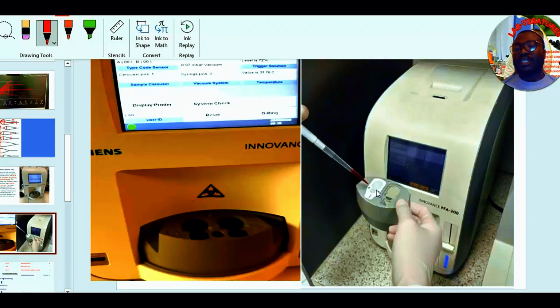So a small aperture will now represent where the tissue is injured, and your blood sample will be forced through it, and it has got the lining with collagen, and there is a reagent of either ADP or epinephrine. So whilst the sample is forced through that part, platelets get activated in the presence of collagen and epinephrine in one cartridge, and then collagen and ADP in another cartridge.